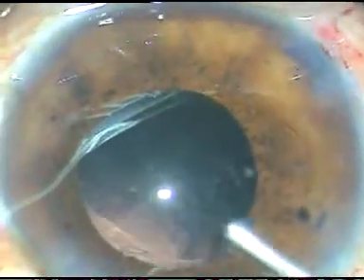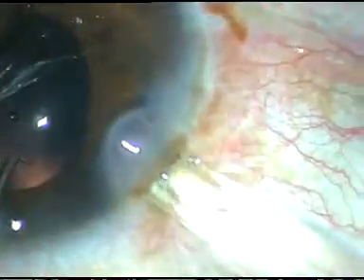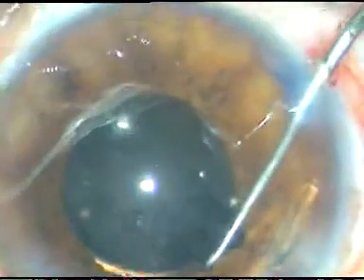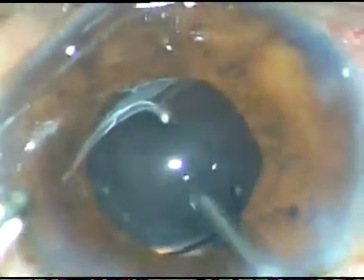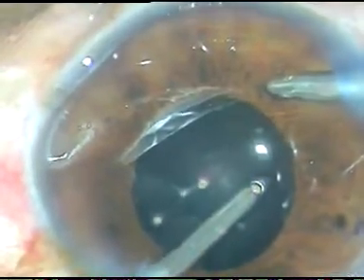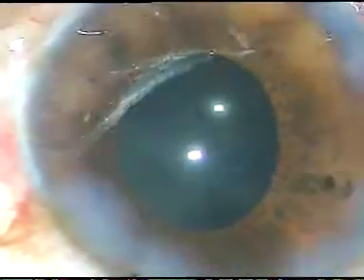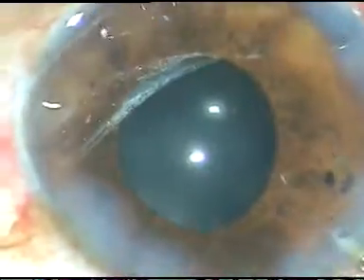Now viscoelastic substance is injected, and a foldable intraocular lens is implanted in the capsular bag. The leading haptic has gone into the bag. I am introducing a Sinskey hook through the side port at 8 o'clock and placing the trailing haptic into the capsular bag. Now I remove the viscoelastic substance thoroughly. After thorough removal of viscoelastic substance and hydrating the side ports, the anterior chamber is formed and the case is concluded.